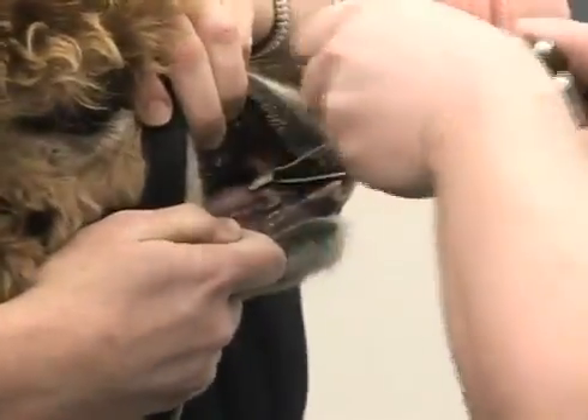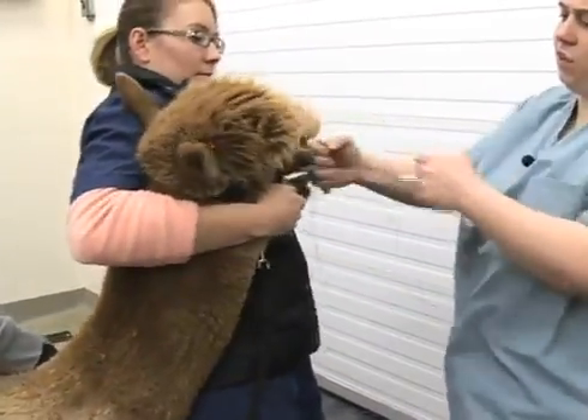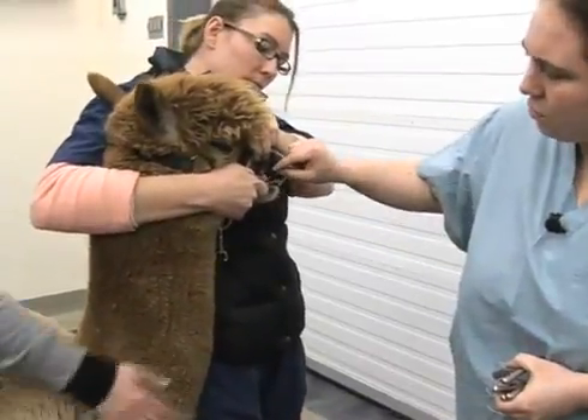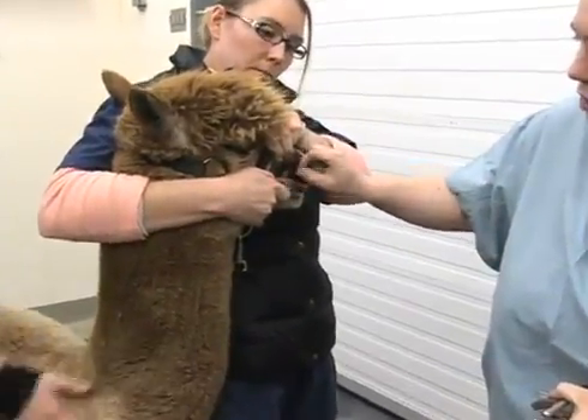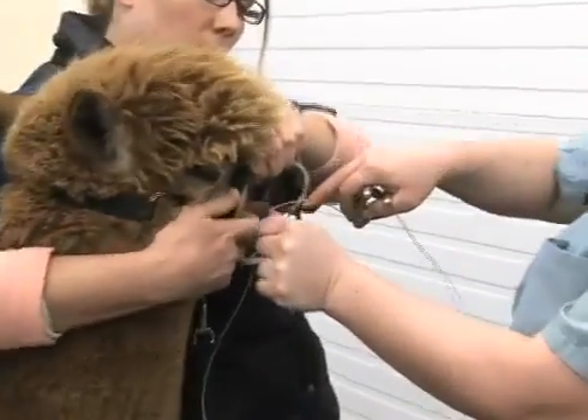Again, we slip the wire back behind the curve of the tooth, close to the gum line, and provide even pressure using long, even strokes — and eventually that tooth will pop as well. Sometimes you'll have a little residual attachment, but usually you've got enough of it that you can easily pluck that piece out. Then the last one is on the bottom jaw.